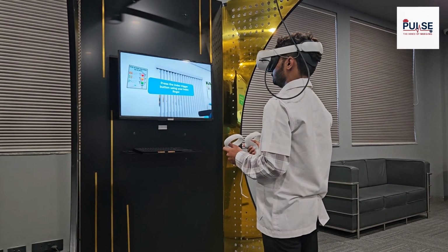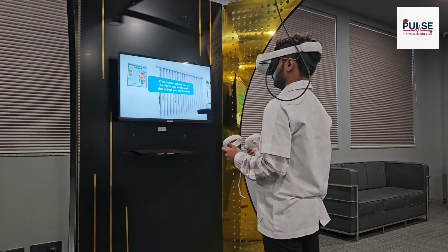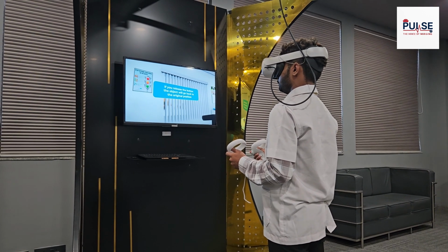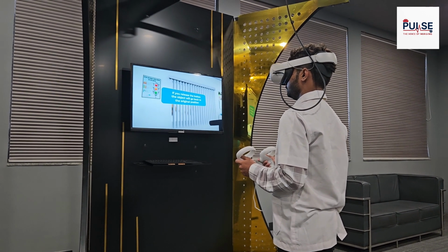Press the index trigger button using your index finger. This button allows you to perform any action with the object you are holding. If you release the button, the object will go back to the original position.